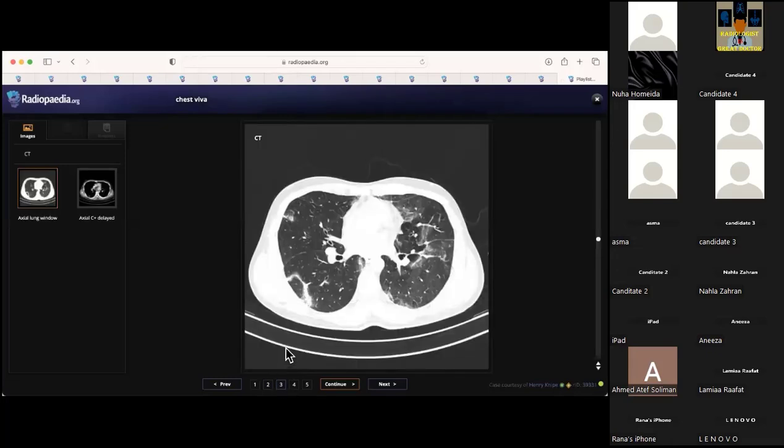So it could be in the differential. I think, you know what, it could be mentioned in the differential. This case was just picked up from the bronchoalveolar lavage, hence the diagnosis, but it is a very valid differential diagnosis.